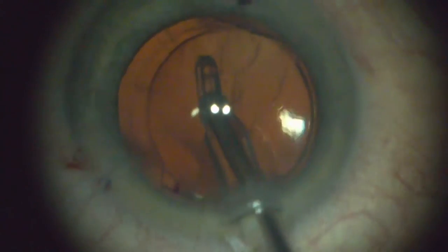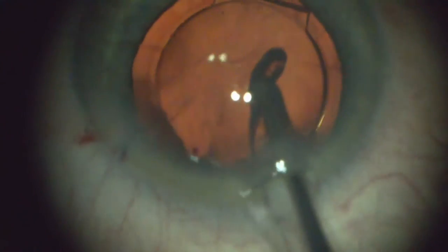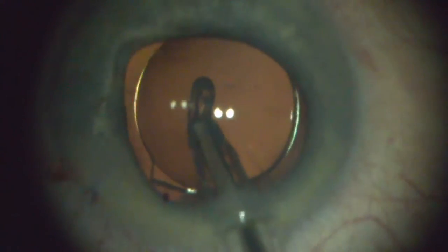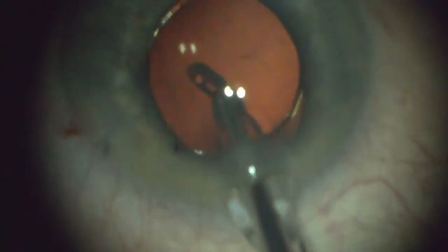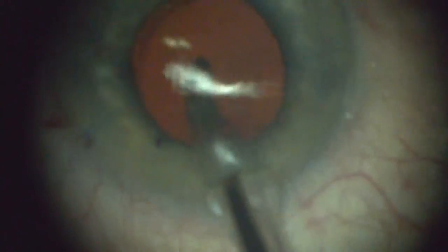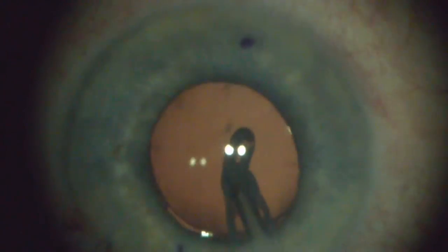Now it looks like it does here, but it really doesn't. This gives you a good idea that this lens is where it's supposed to be. A lot of times the pupil comes down and you can't see the markings on the toric lens, so this allows you to see that if you push the iris back, the lens is still in very good position.